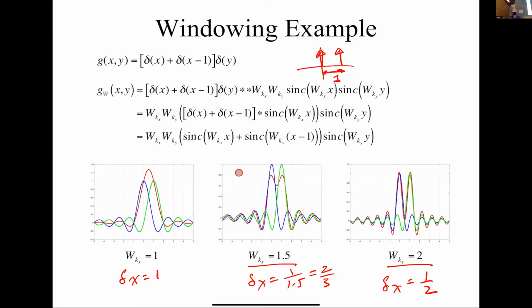Or let's say you're imaging a child or an infant. You may have 10 minutes where they're going to be still, right? And you don't want to have to sedate them, right? Now, obviously, if it's very serious, you will sedate them and anesthetize the child, but you would rather not, because even anesthesia is a risk.